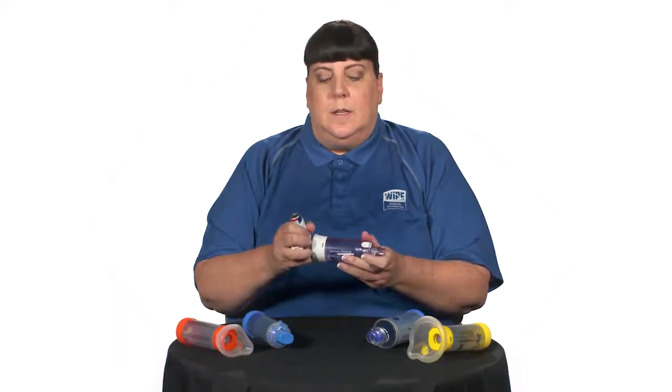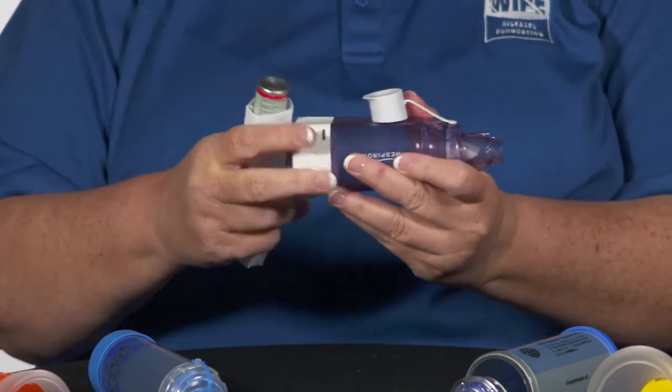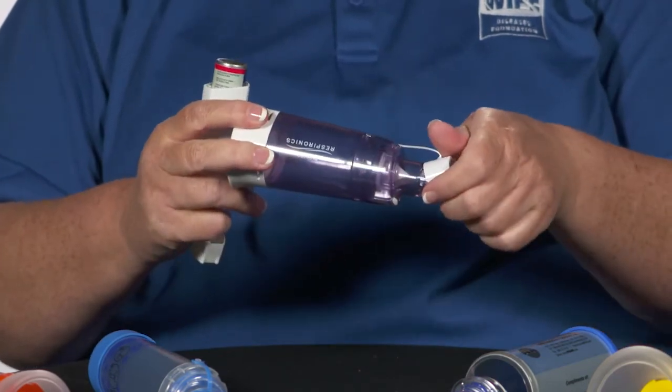When you finish taking the medicine, separate the two devices and replace the dust cap on both the valve holding chamber and on the metered dose inhaler.